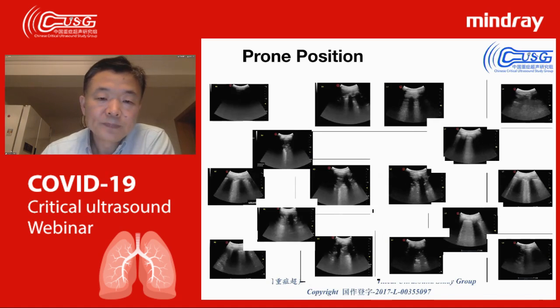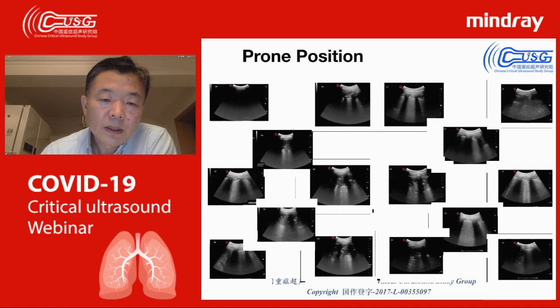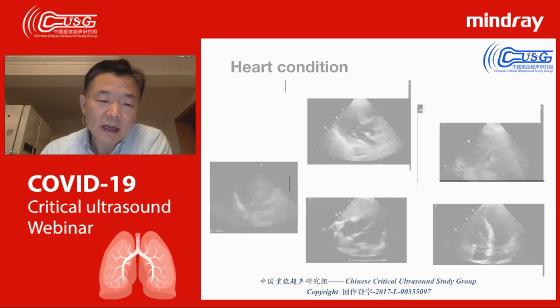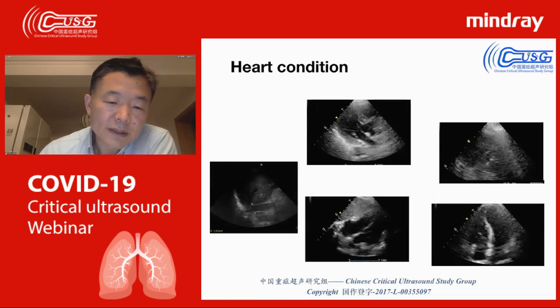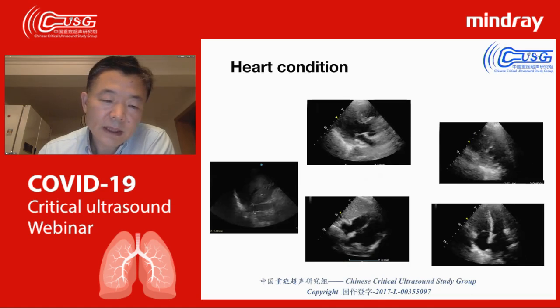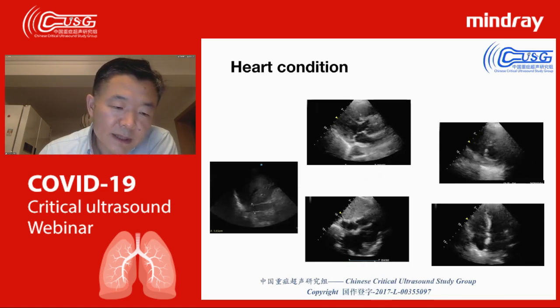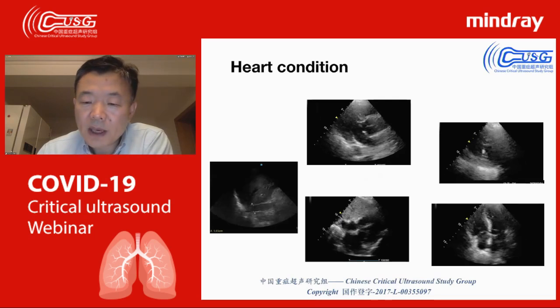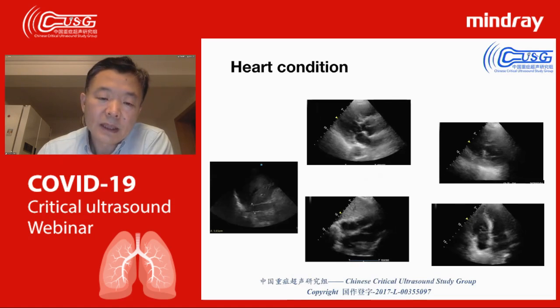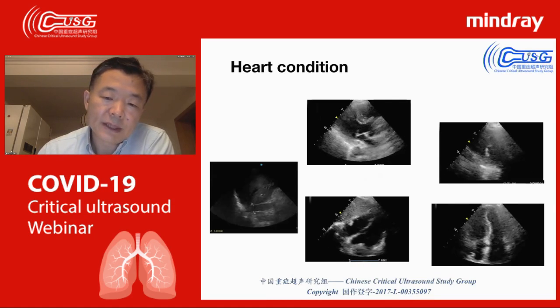And so I think my time is more limited, so I'll just speed up. So the heart condition now is, you see, much better. You see here. The heartbeat is more or less okay, and the IVC is 1.93, and the right side and left side ratio has become more reasonable. So the patient's condition is getting better.